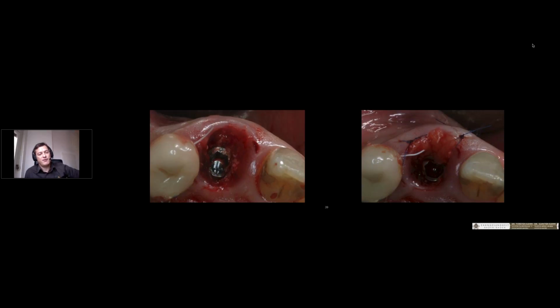And then it's important to get a very good implant design, so that you get very high primary stability in the apical side of the implantation. This works only with a tapered implant, with very aggressive threads like the Tree implant, if you have a triple thread, because this creates much more pressure inside the bone. If you have only one thread, not a triple thread design, it's not possible to get pressure inside the bone, because the thread goes into the same position of the bone. It's not possible to get very high pressure.